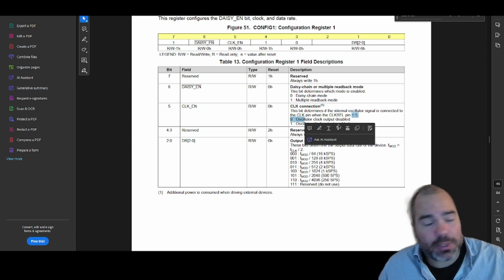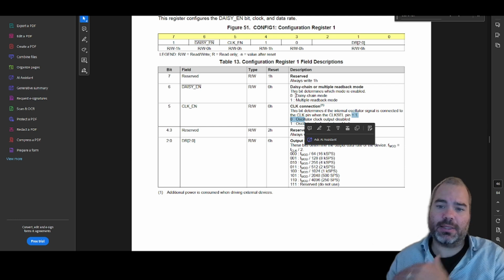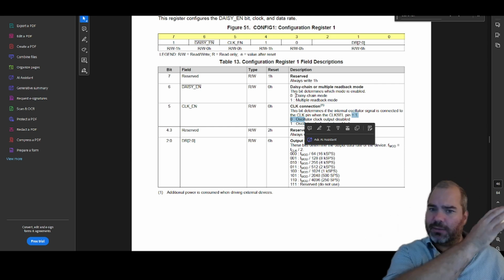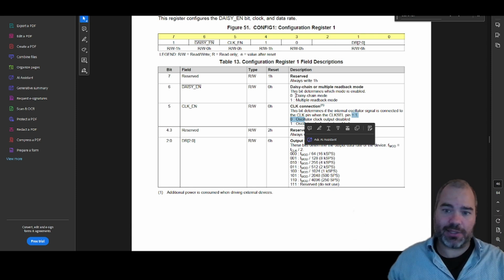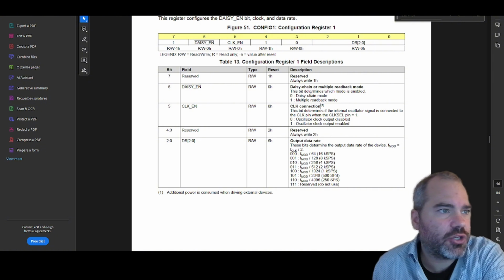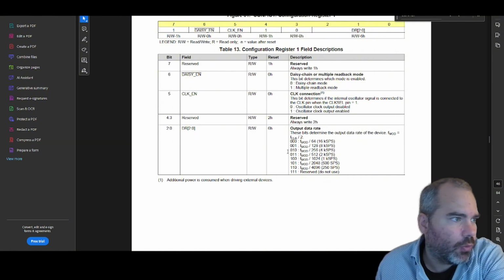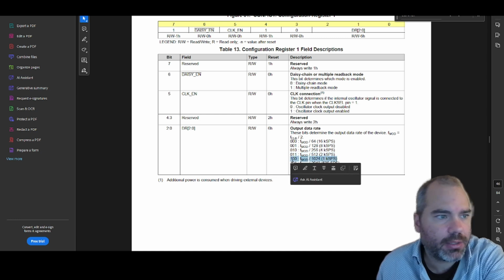No output, that's okay. So this is when you assemble multiple ADS1299. This is what you get, the daisy mode, when you want to have 8, 16, 24, 32 channels. You daisy chain the chips, and you need to propagate the clock this way. But the one that is interesting, so we have 94, and 4 is equal to 100. So we have a sampling rate of 1 kilo sample per second.